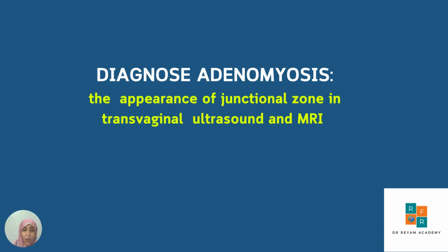Today we are going to talk about important pathology that affects women in reproductive age, and this is adenomyosis. Our focus is on the diagnosis of adenomyosis, specifically exploring the role of junctional zone in the diagnosis. And our question is, is junctional zone a valid diagnostic tool? Let's see. But before we jump into answering this question, let's explore first what is junctional zone and what role it plays in the diagnosis of adenomyosis.